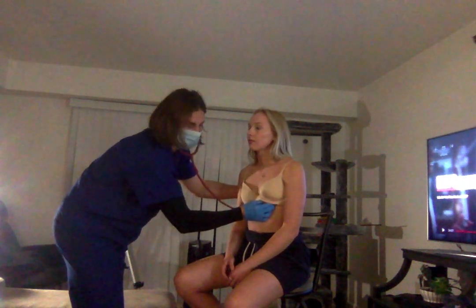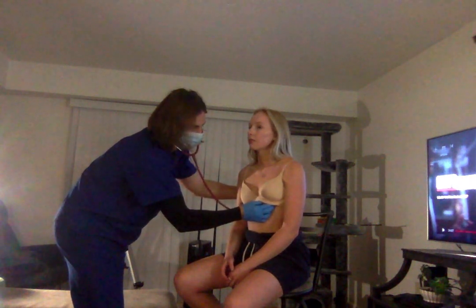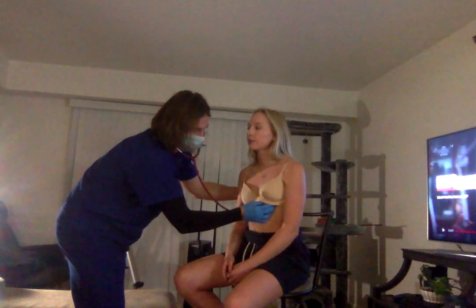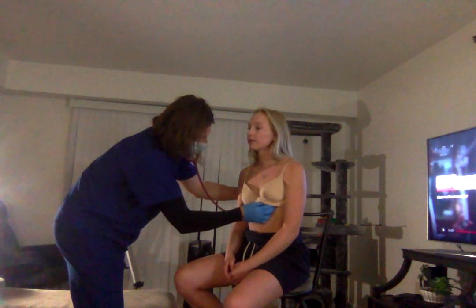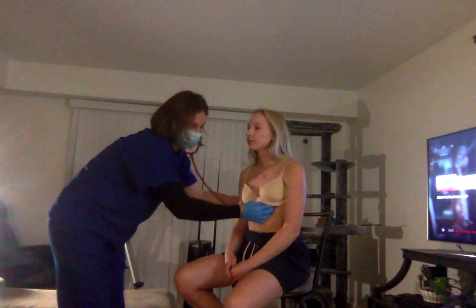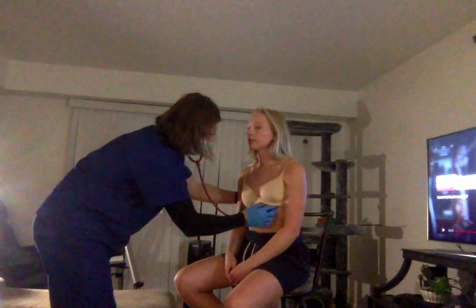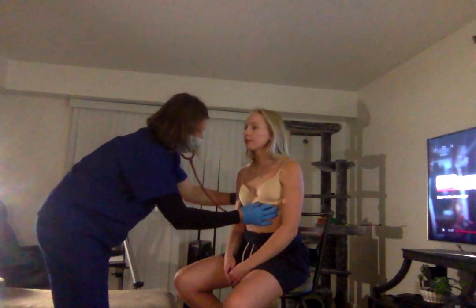I can hear the normal S1 and S2 sounds. I don't hear any S3 or S4. I don't hear any murmurs or abnormalities. The rhythm is regular, so I'm going to go ahead and count the heart rate. So I will count for 30 seconds and multiply times 2.